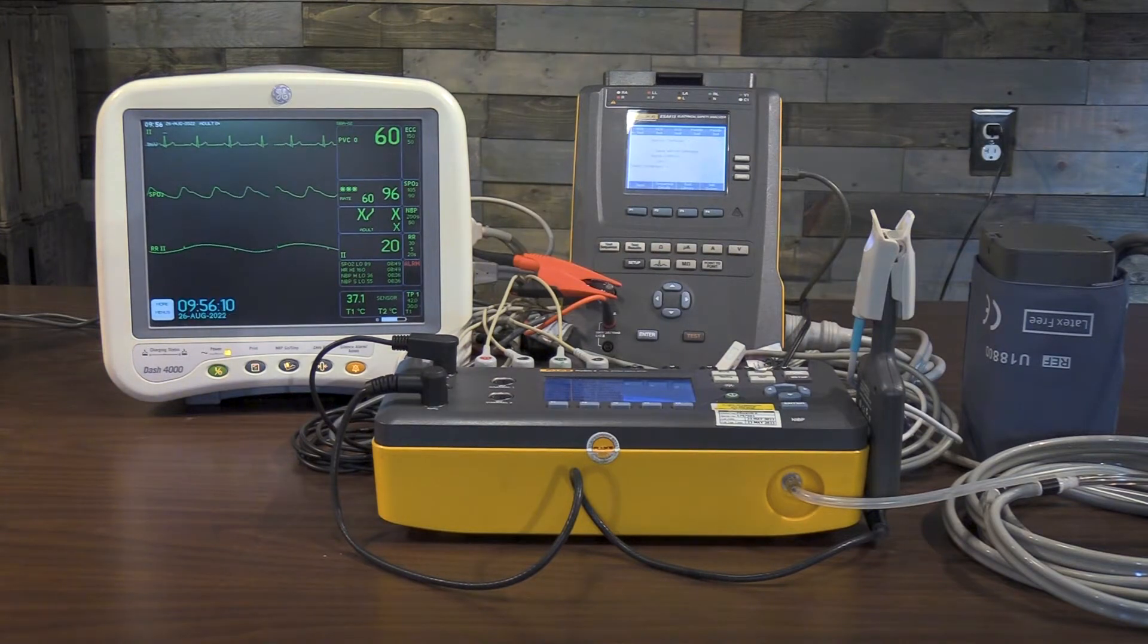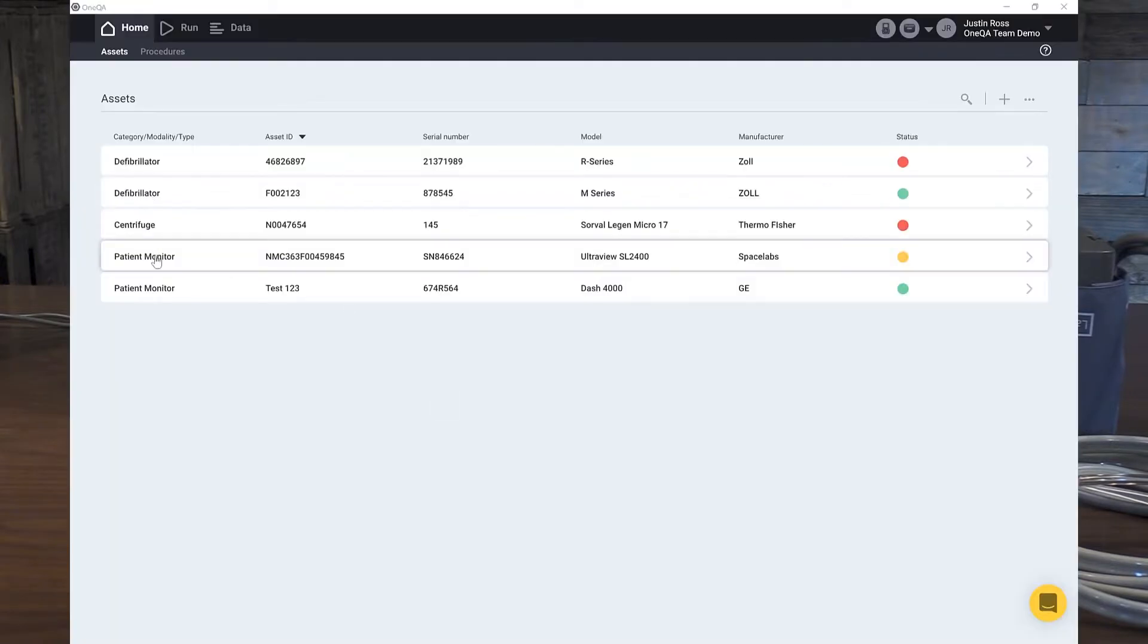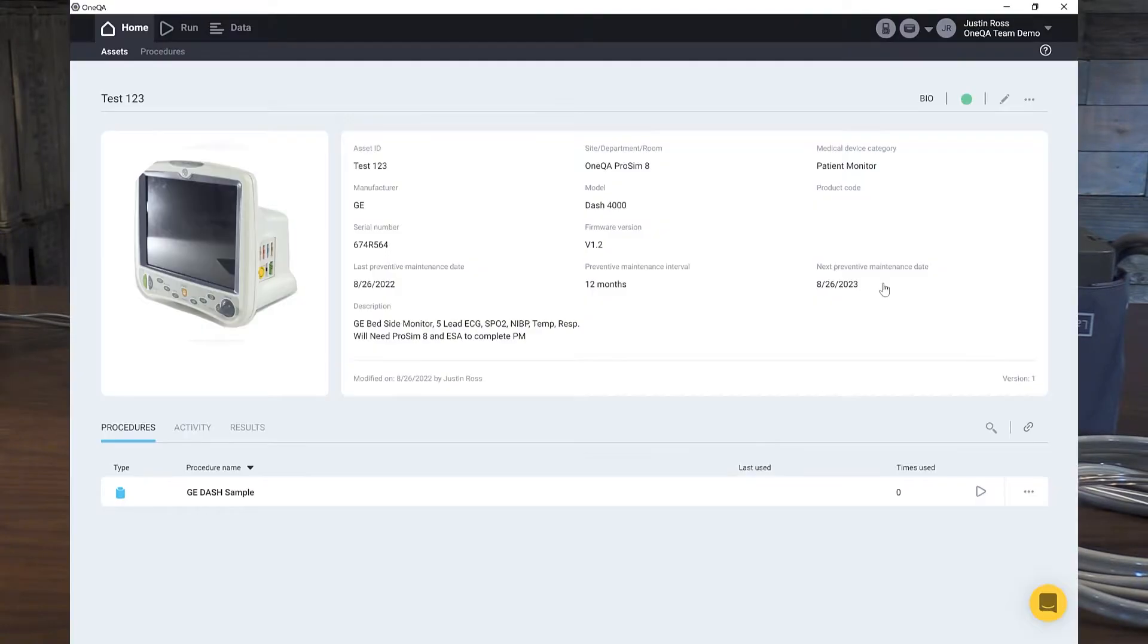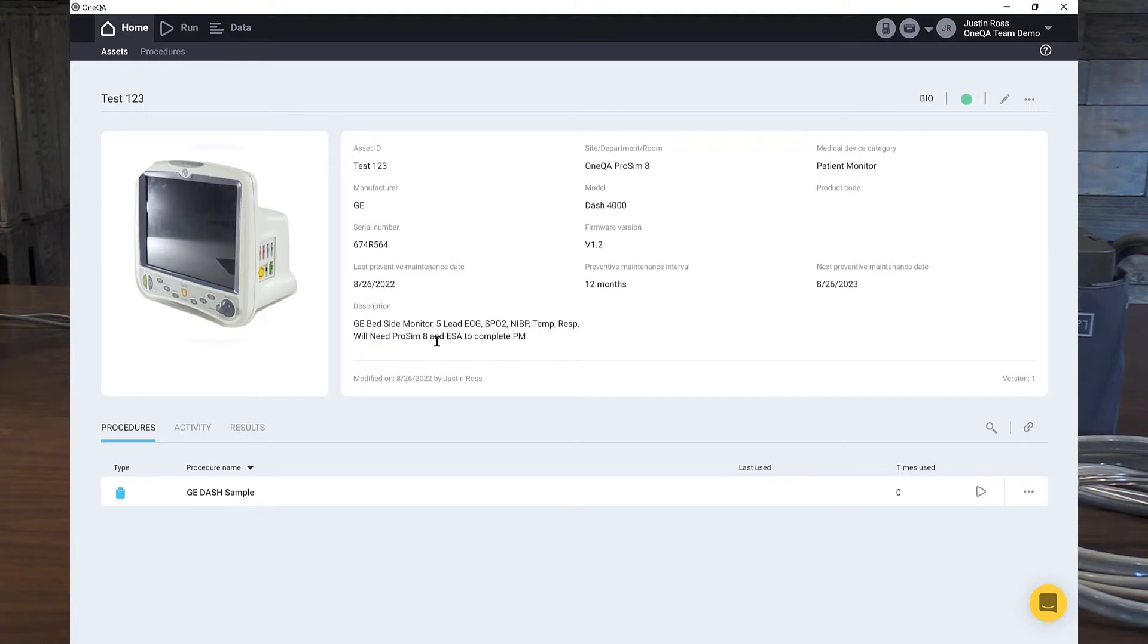So here we are in OneQA and you'll see our asset list and we'll go down to our patient monitor and click on it. And here you can see the picture of the Dash-4000 so we know we have the correct monitor. You'll also notice we have all the information, the asset tag ID, its location, the device type, manufacturer, model, the last time it was serviced, the next time it's due, as well as some special notes that I entered into here so I know exactly what I need to do to be able to perform this PM. I need a ProSIM-8 and an ESA, which we have both on the desk.